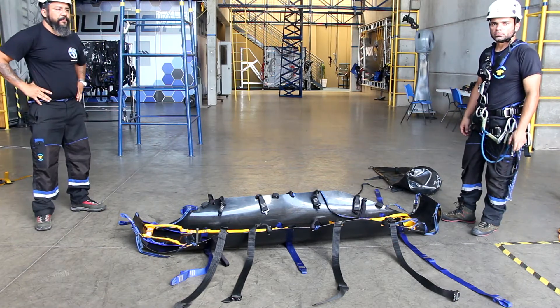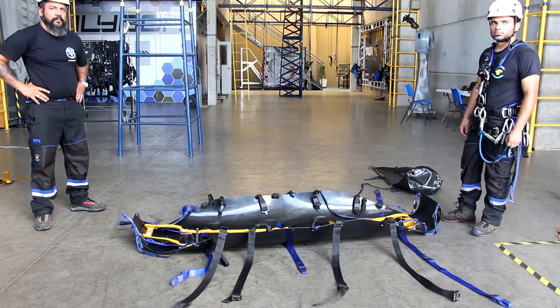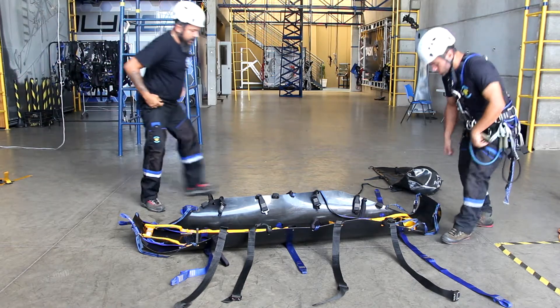Rolling up the stretcher: put all the straps back inside the stretcher.